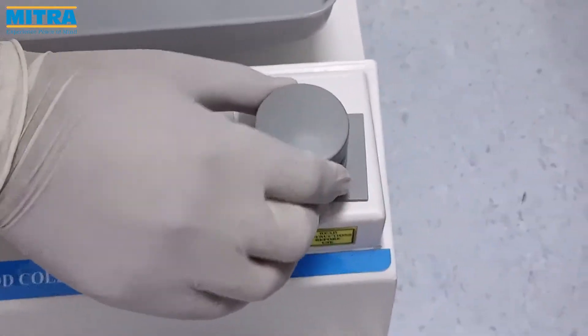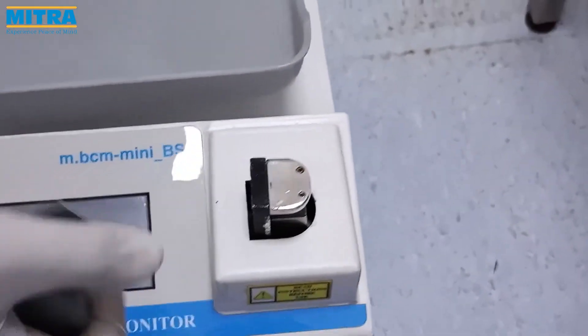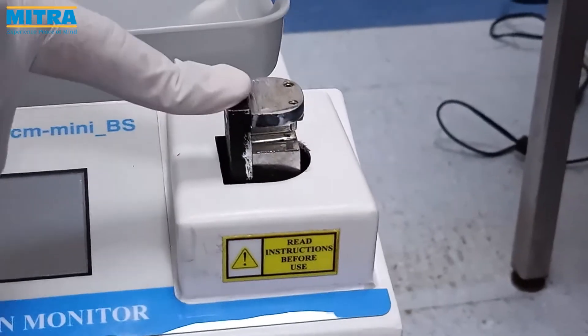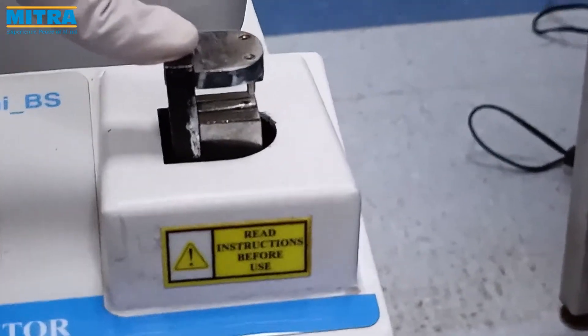This is the removable head cap which covers the clamp. The clamp is used to clamp the tube during the process and to regulate the blood flow from vein to bag.